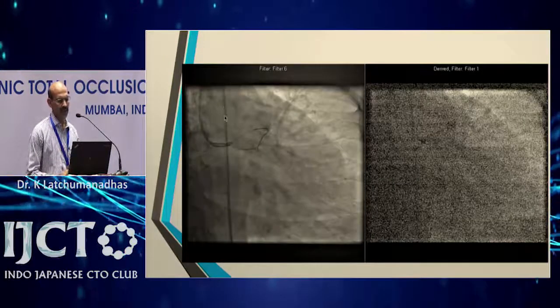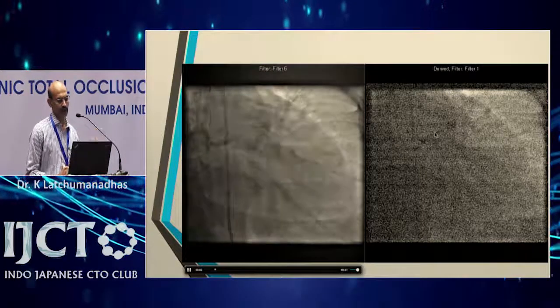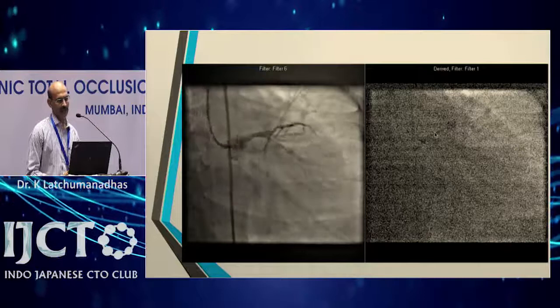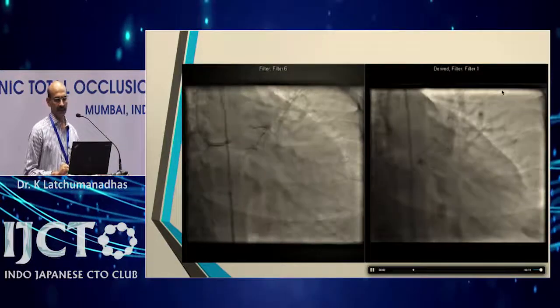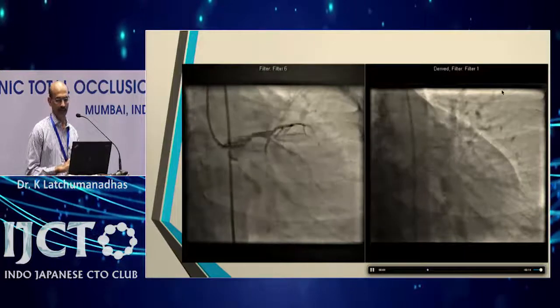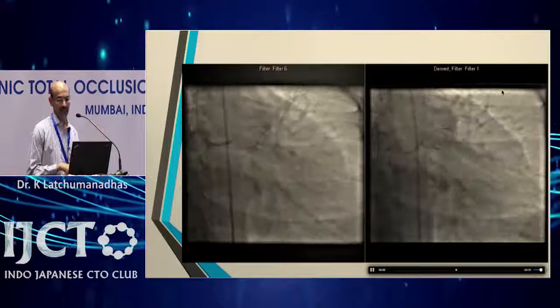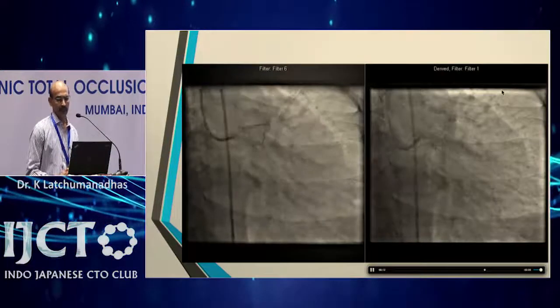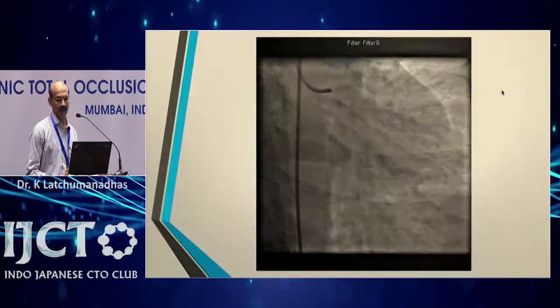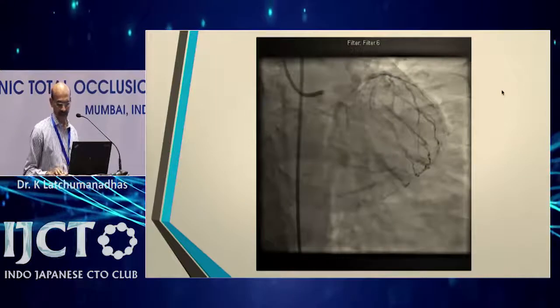This is one of the cases where the side branch is used for a near total occlusion into the branch, where it's difficult, and subsequently the wire enters because of the support being given, because without backing up of the guiding. Even with this, there is some kind of backing up seen. The wire progresses as well. Then you just finish the procedure with your stenting finally.